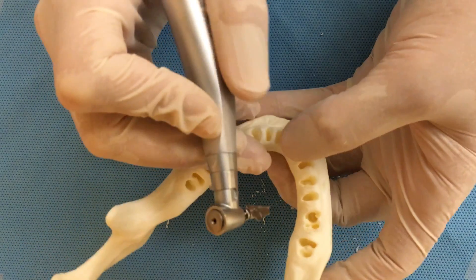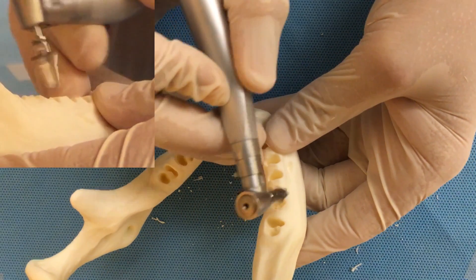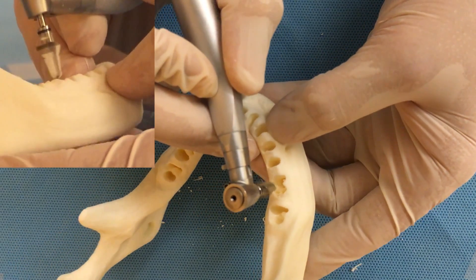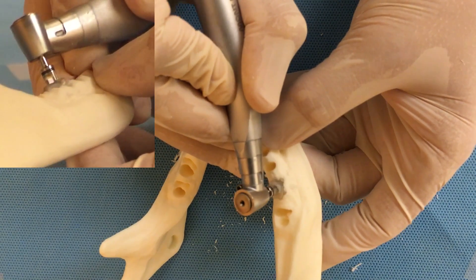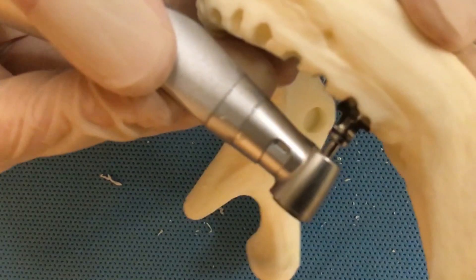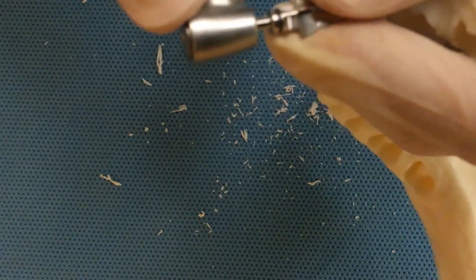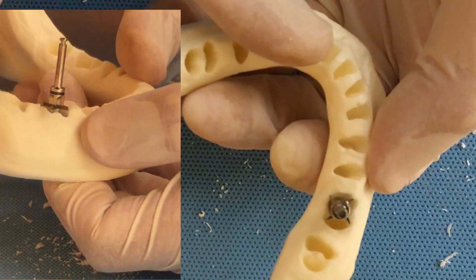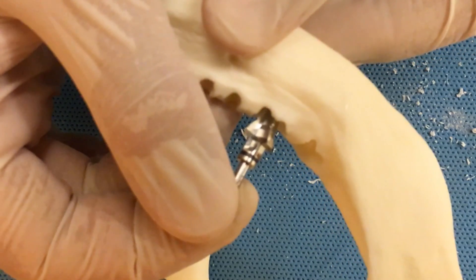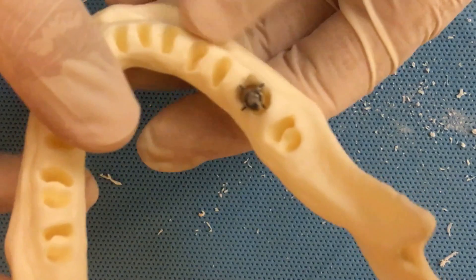Drilling speed for the countersink: 1200 RPM and very little pressure. If we apply too much pressure, the countersink is going to bounce too much — so very little pressure at 1200 RPM. Once done with the osteotomy, the countersink should sit at the correct depth when placed into the bone. If the countersink is too high, you must drill deeper. This is the ideal positioning of the countersink once you are done with the osteotomy.